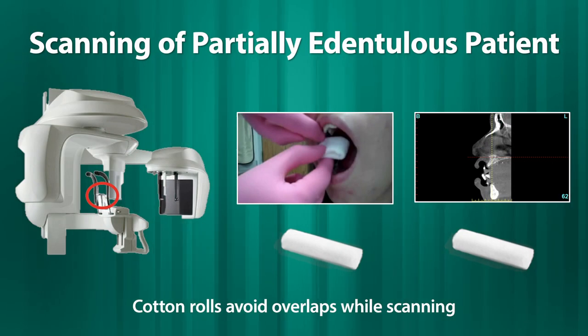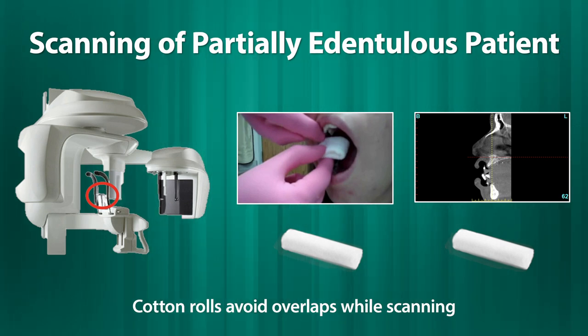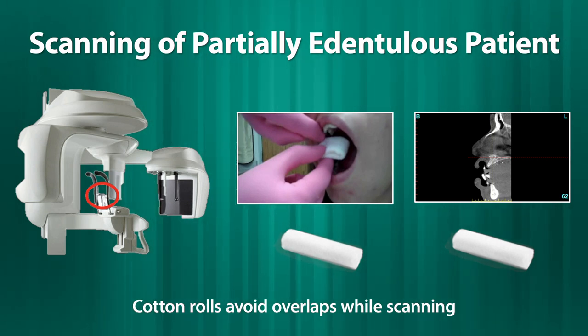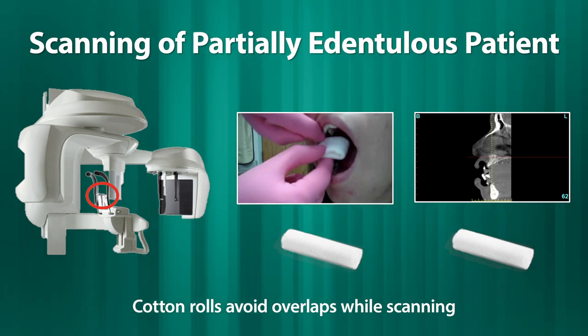Also, it is advisable to separate the upper and lower teeth during scanning to avoid the overlap of the incisor edges and the occlusal surfaces of the mandibular teeth while planning for maxillary implants.